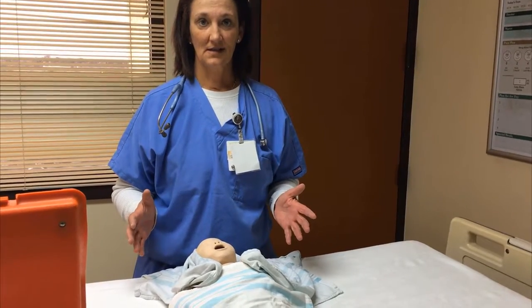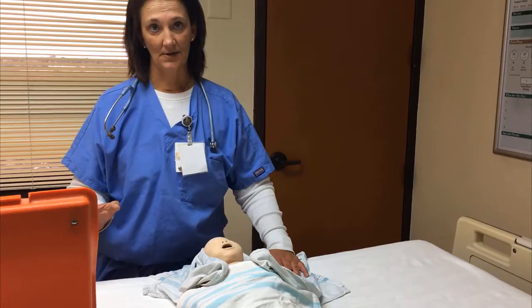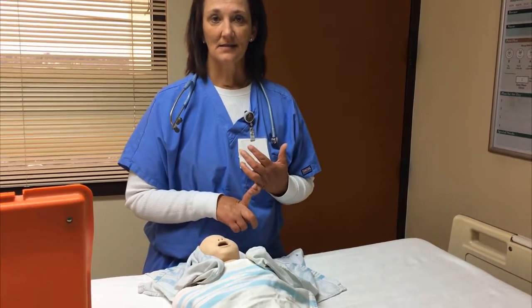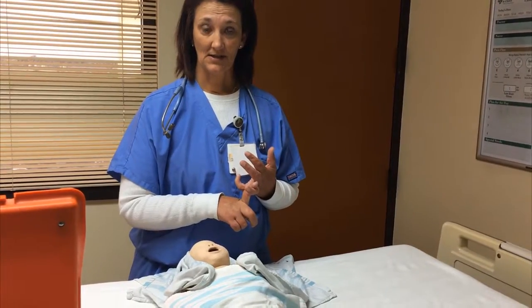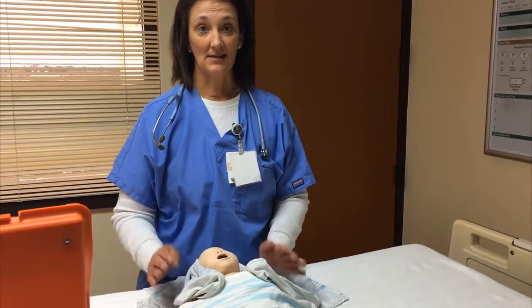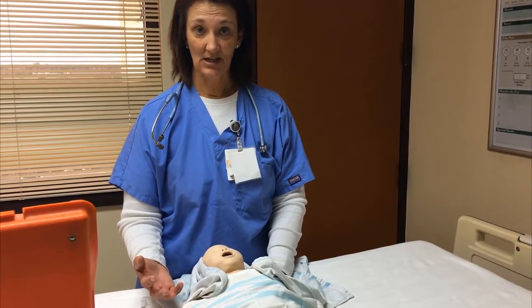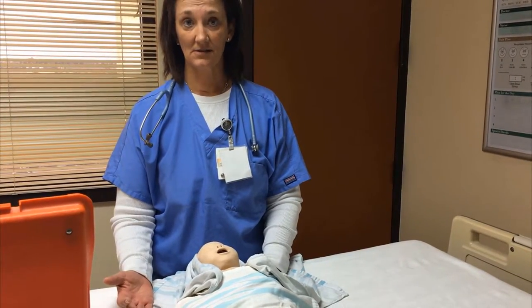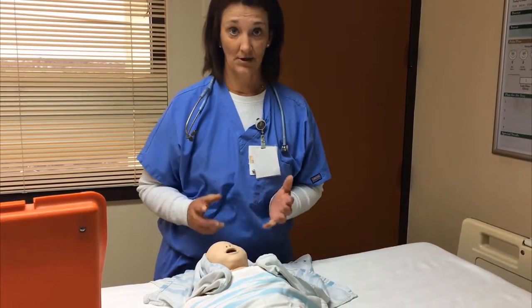So now what we're going to discuss is the use of CPAP. We're going to be talking about the right side of the algorithm. So if the baby is having labored respiration, or the O2 sat is not increasing, or the baby has persistent cyanosis after using supplemental oxygen, we may want to consider the use of CPAP. So for this lesson, what we're going to discuss is how to do the CPAP.